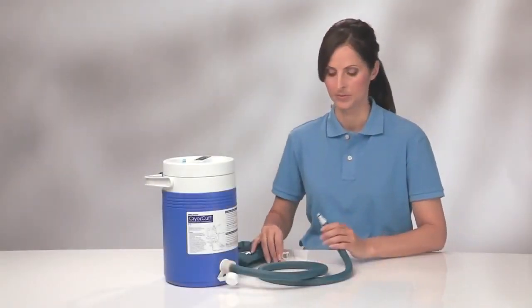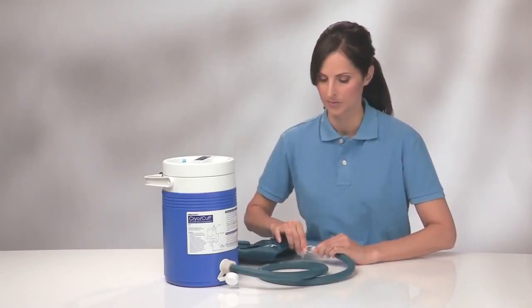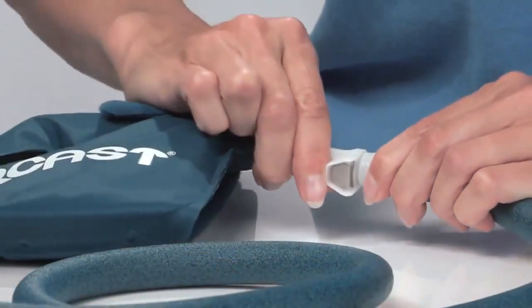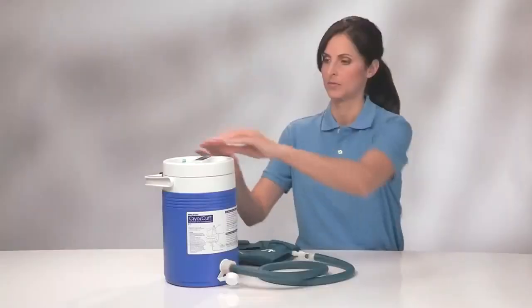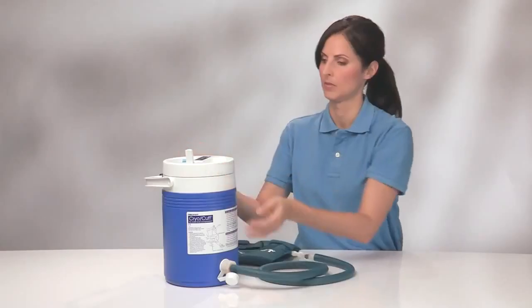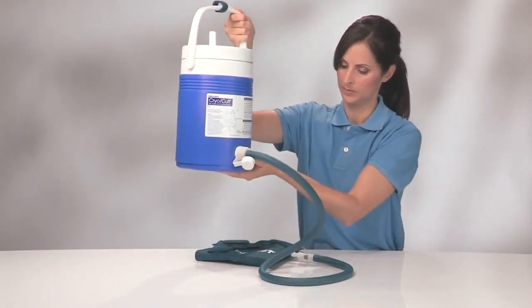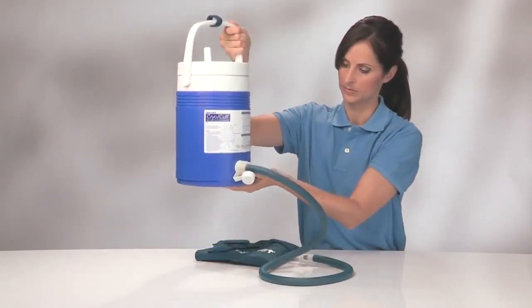To fill your cuff, connect the blue tube to the cryo-cuff. You should hear a slight click, indicating a secure connection. Open the air vent on the cooler lid. Next, raise the cooler no higher than 15 inches above the cuff for approximately 30 seconds until it fills.